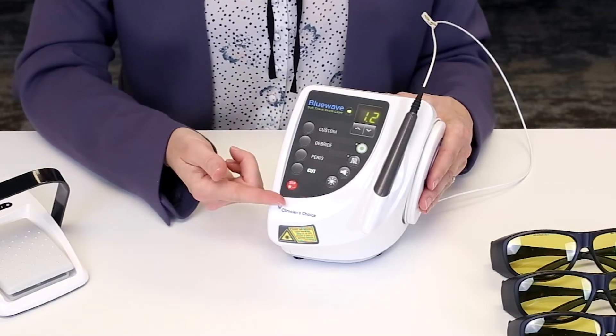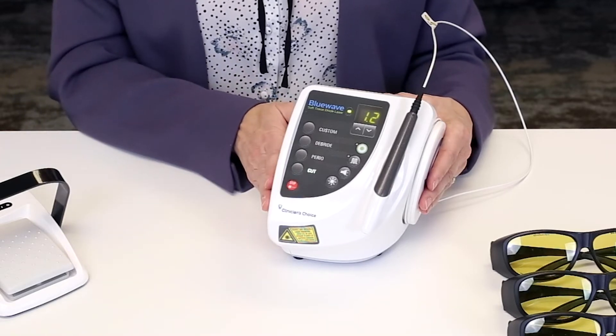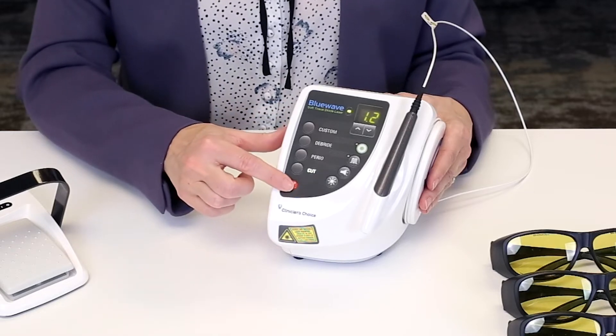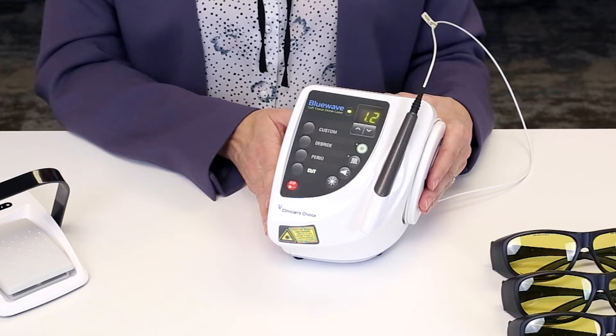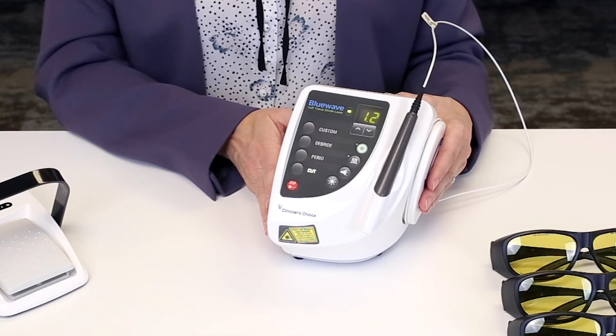Next you'll see your emergency stop button. If there's ever an issue simply press this button and the entire unit will be disabled. To re-enable the unit you will have to manually turn it off and on from the back.